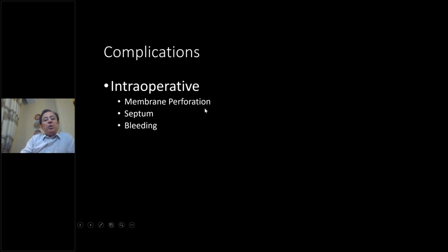And if the perforation is more than 5 millimeters, if we can lift the membrane in another part very well, then we can put a collagen membrane, but the collagen membrane must be fixed over the bone, not inside the sinus but outside the sinus, with a tack or with a screw. We must tighten it, to prevent the membrane from moving inside the sinus.